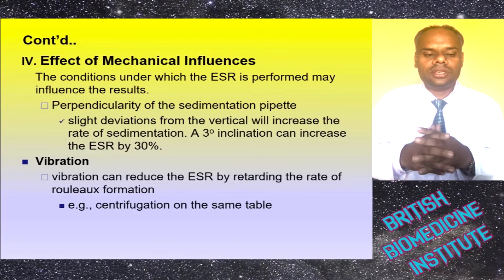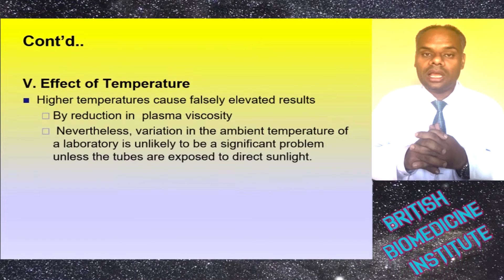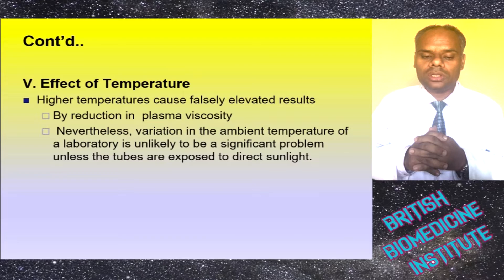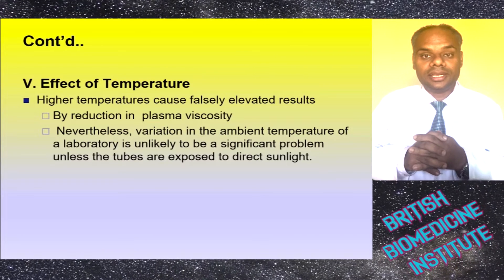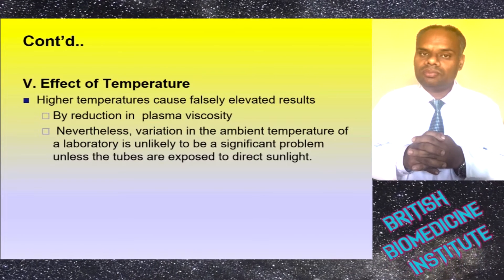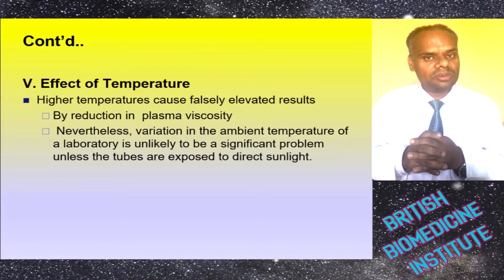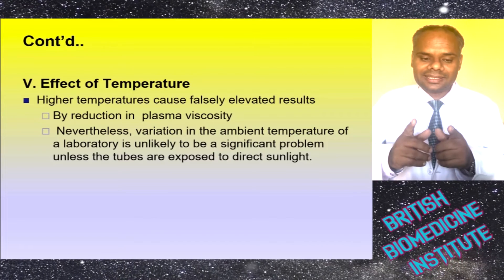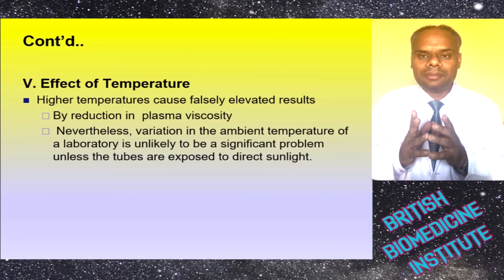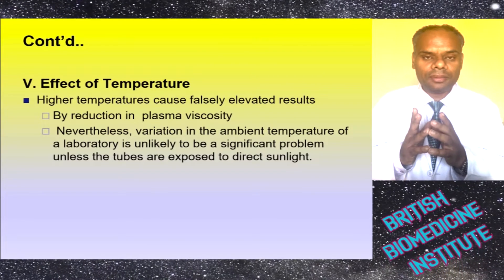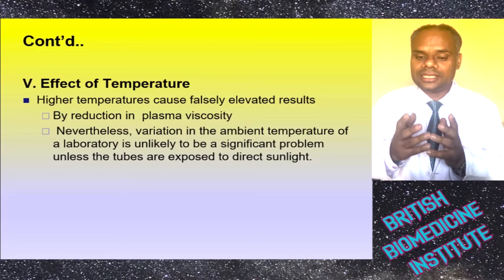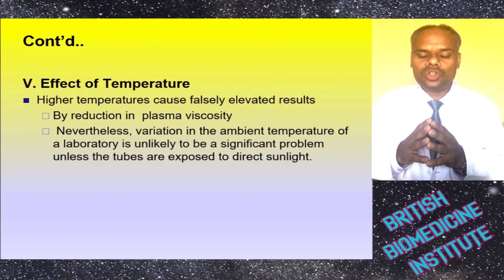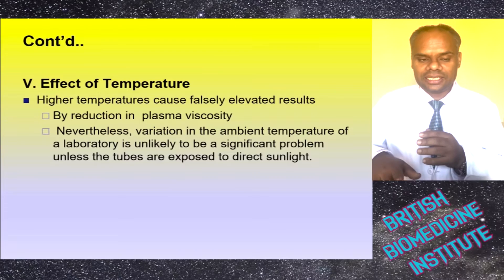The fifth factor is the effect of temperature. High temperature can falsely elevate results by reducing plasma viscosity. However, variation in the ambient temperature of the laboratory is unlikely to be a significant problem unless the tube is exposed to direct sunlight.